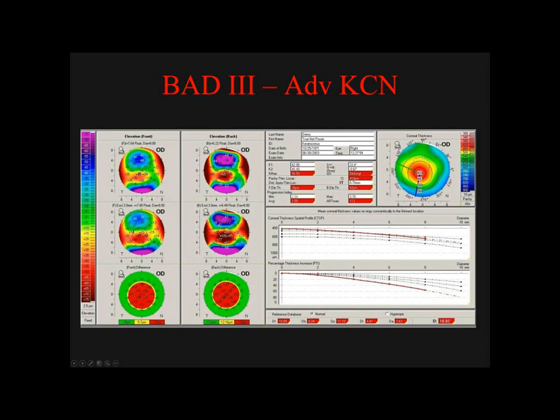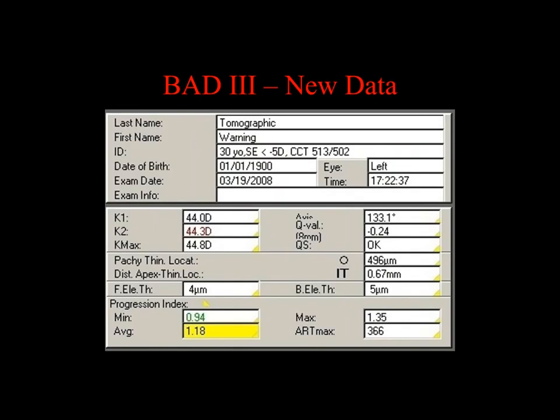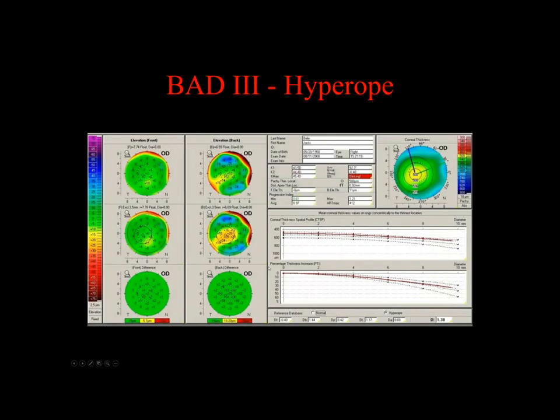So this is what the new or the current looks like, and you'll see all these values here are reported as standard deviation. So even though we only show 5 here, this is in the regression analysis, this is in the regression analysis, this is, and that is. Okay. And again, this is just a close-up of all those yellow triangles. If you put your cursor on it and click, you'll get a drop-down that will explain what each parameter is.